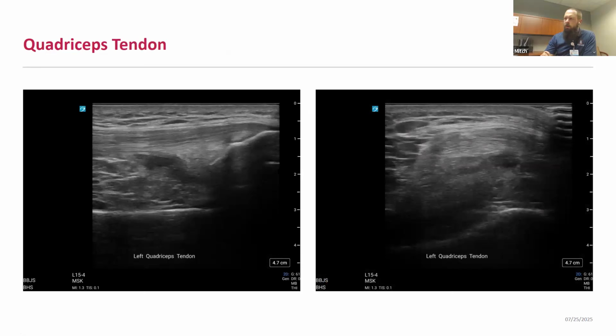Specifically, when ultrasounding the quadricep tendon, typically you want the knee in about 20 to 30 degrees of flexion, which pulls a little tension on the quadricep. If you're in full extension, you'll get more of a concave appearance of the quadricep, which can lead to anisotropic artifact and potentially missed or false diagnoses of tendinosis or tendon injury. You'll want to look at it both in long and short axis.